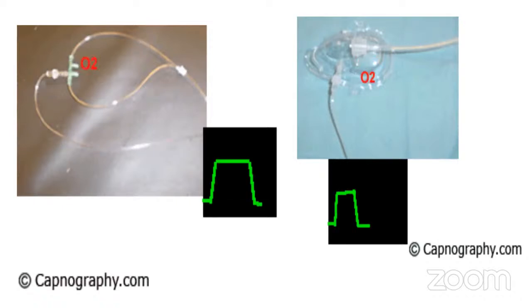Okay, is this it, sir? So that is connected to the nasal prongs. Connected to nasal prongs. Can we use it for a side stream for ET tube, Anjula? Side stream we are using for endotracheal tube, no? Which is also a side stream, no? Yeah, but side stream, but yeah. It is a side stream.